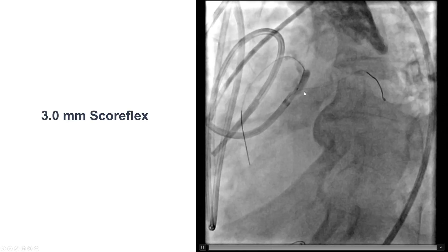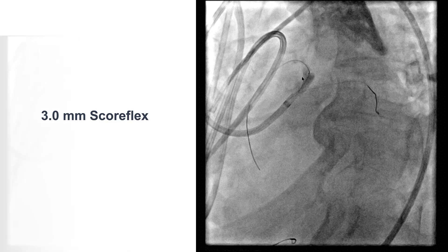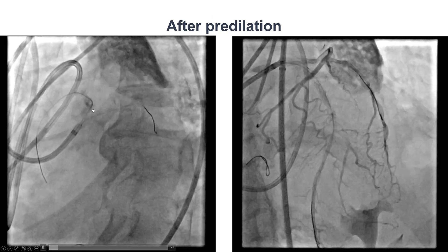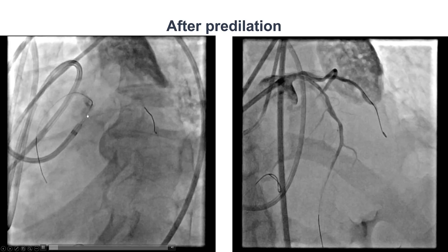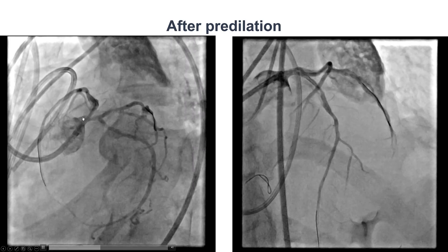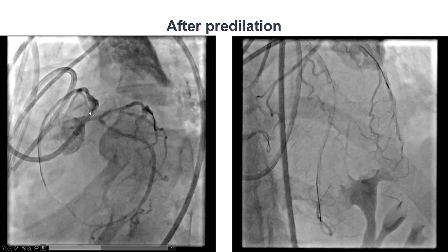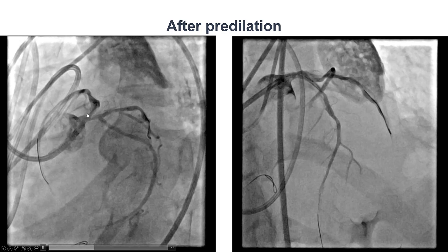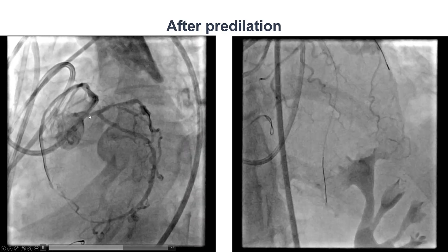We used the Scoreflex balloon again to predilate the LAD, and despite heavy calcification there was good expansion. IVUS confirmed that most of the calcium was deep. After predilatation, we achieved good flow into the LAD, which appeared to be a good-sized vessel. However, there was some disease or possible dissection next to the origin of the circumflex. When performing PCI of proximal or ostial LAD CTOs, we must ensure there is no compromise of the circumflex — in this case from a possible dissection plane — so we decided not to leave the circumflex lesion untreated.